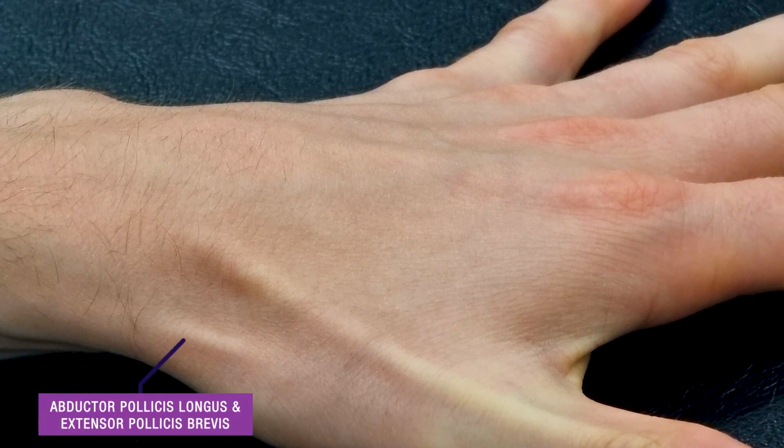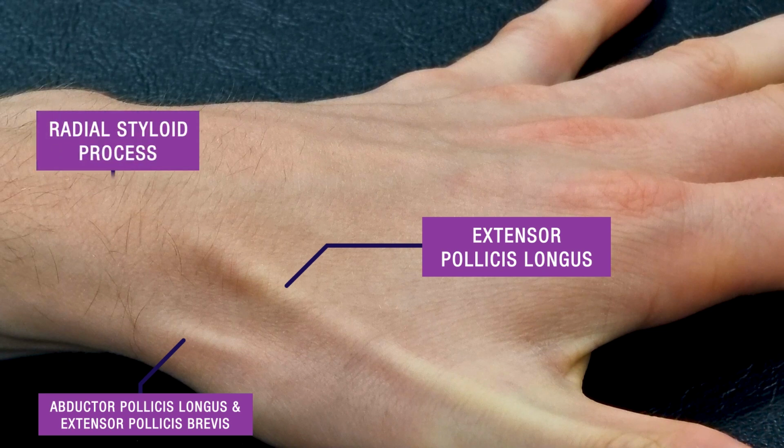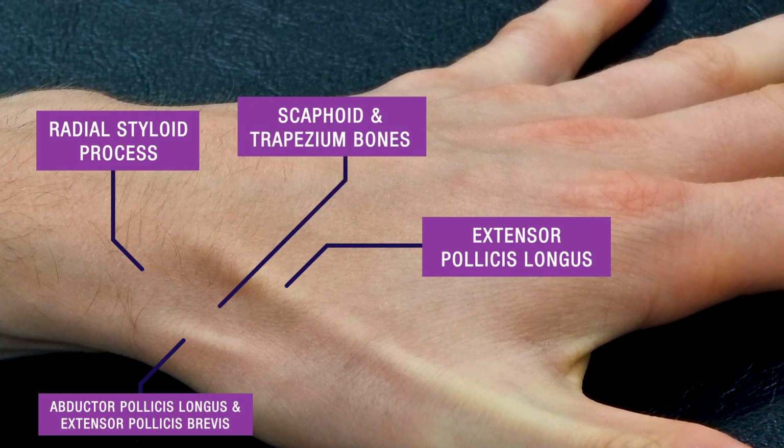Laterally are the tendons of abductor pollicis longus and extensor pollicis brevis. Medially is the tendon of extensor pollicis longus. The proximal border is formed by the radial styloid process. You can palpate the radial artery within this snuff box. At the floor of the triangle are the scaphoid and trapezium carpal bones.